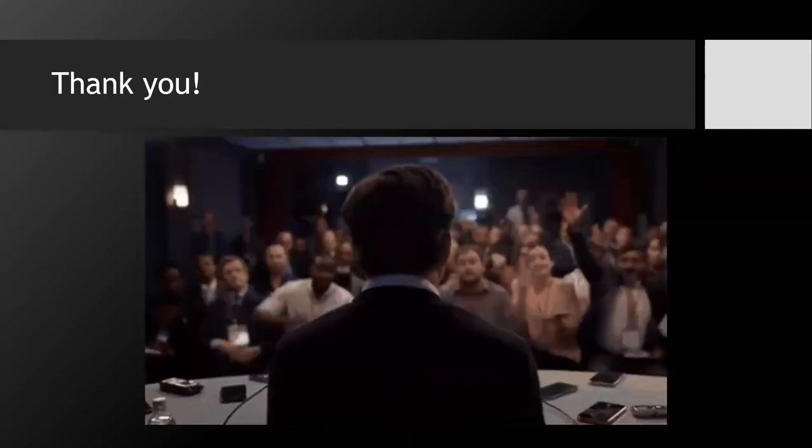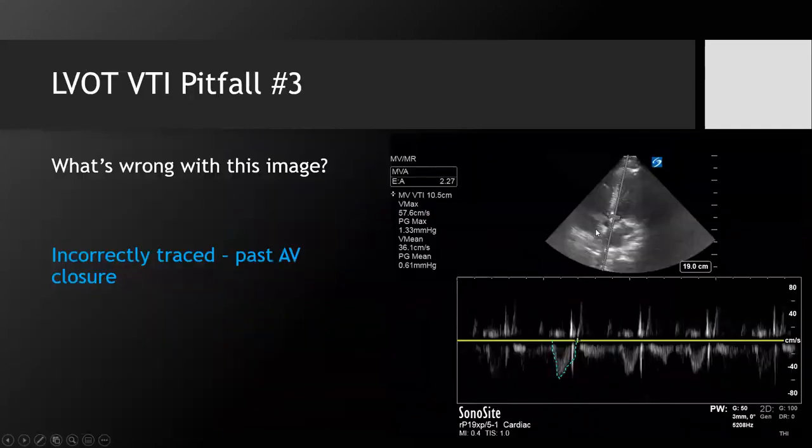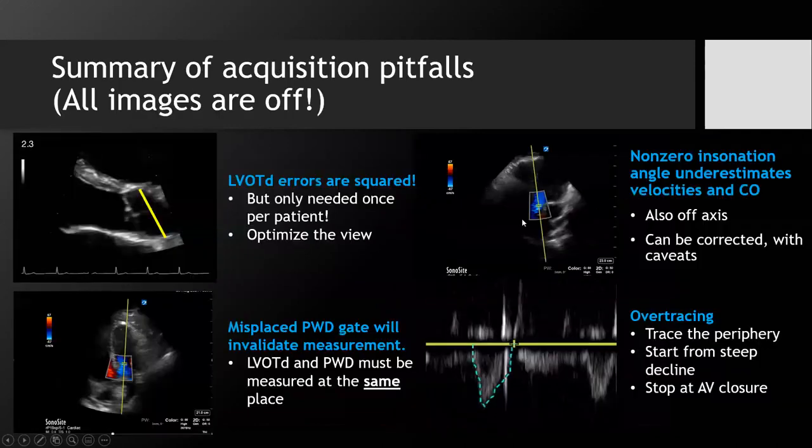Gotcha. One of the ideas behind doing that, I don't want to scroll all the way back up, but I showed you, is identifying that beautiful blue coming out of the LVOT. In addition to optimizing your angle, it also gives you a sense of whether there was turbulent flow. If there was, usually the speeds get extremely high and go above the resolution of color Doppler, and it starts making a sparkling appearance, bright blue and red and orange. That's one clue that you're dealing with turbulent flow, and you should be cautious and not use Doppler for that.